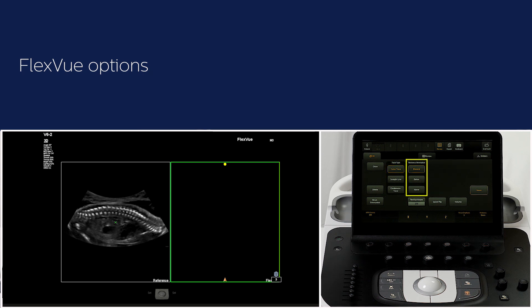The thickness orientation will be on bilateral by default. This refers to the dotted lines above and below your drawn reference line. You can select bilateral, above, or below. This can also be changed later.